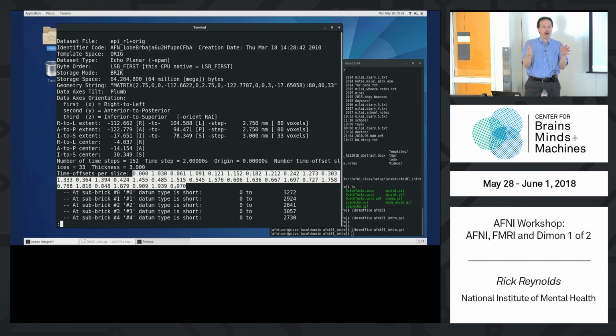So how good are we at sitting still and not moving 0.3 millimeters? You know, you have to stop breathing, or you can't stop breathing because you're going to be in the scanner for 2 hours. You have to stop your heart because your heart keeps sending your brain up and down, so you've got motion, you can't stop your heart. So we have all these little issues to deal with. And so it's not too difficult to have motion big enough to have to censor it out or something like that. So that's the bane of FMRI, really.